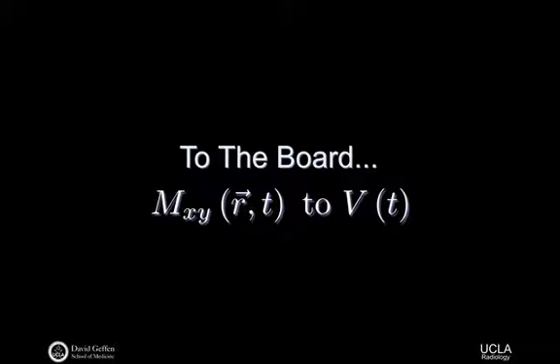So now if we go from here and say, well, what's happening to dMx/dt? We know it's just this cosine-like function, and so it ends up looking proportional to something like minus gamma B0 cosine of gamma B0 t. Do the same thing for our dMy, or d sine. Sorry, thank you. Cosine goes to sine. Here we have our partial derivative of our My term as a function of time, just being proportional to something like cosine. So we have a gamma B0 cosine of gamma B0 t.